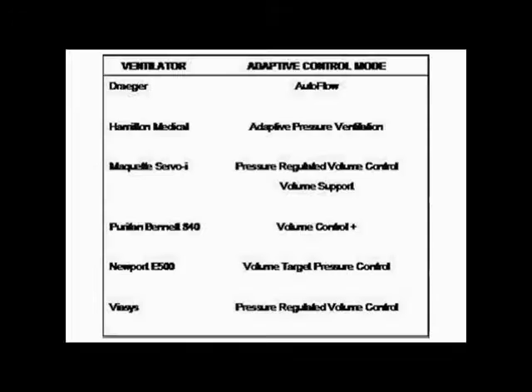Now, what is adaptive pressure control? You might not be familiar with the term, however, you might be using a mode like this every day. As you notice on the left-hand portion of the screen, you can see different brands of ventilators, and on the right, what their adaptive pressure control mode is.